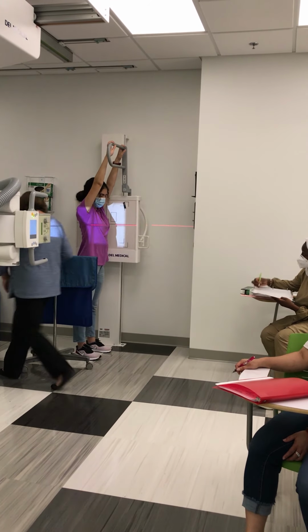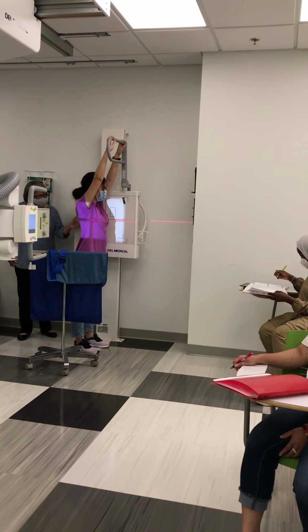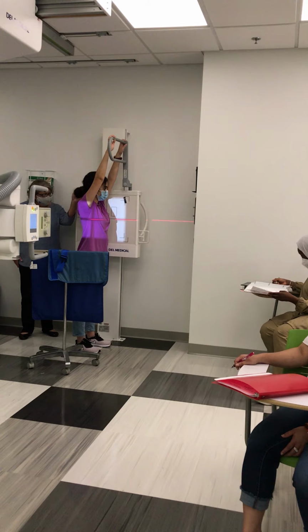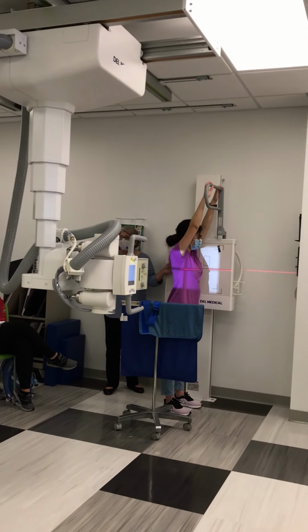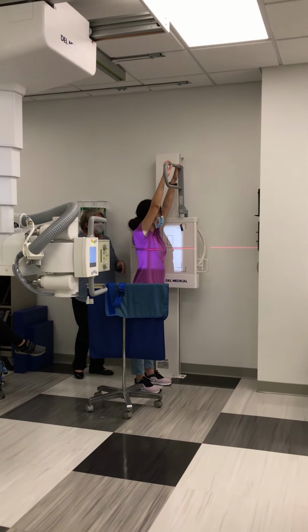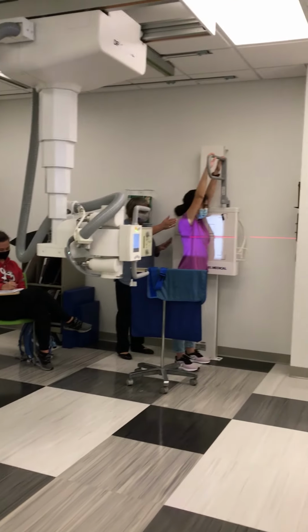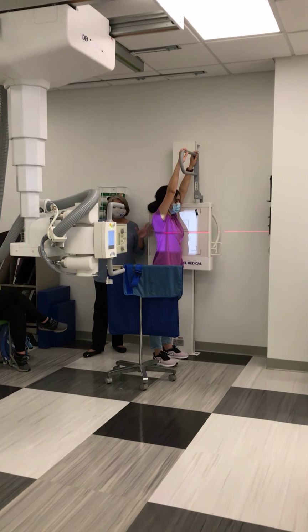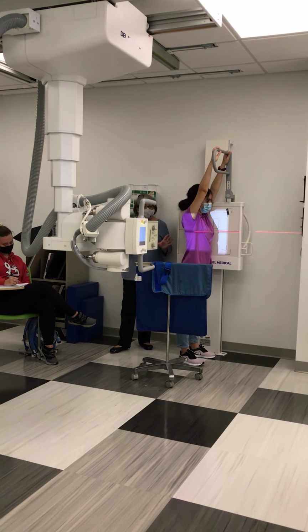Now then, I'm gonna position my patient, and you can see, Alex, there's quite a gap between my patient's left side and the wall bucky. I'm going to tell my patient, step to your left against that board. Okay. Now, her whole side is against the board, from shoulder to hips. That's good, that's what you want.